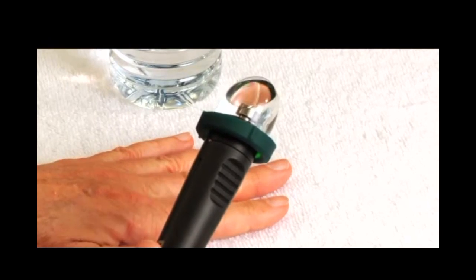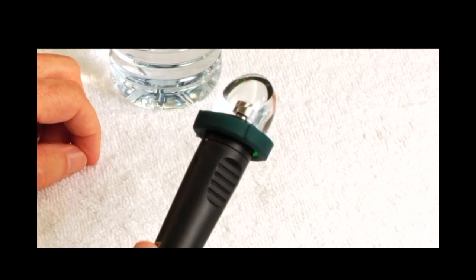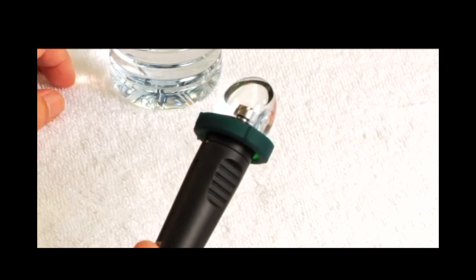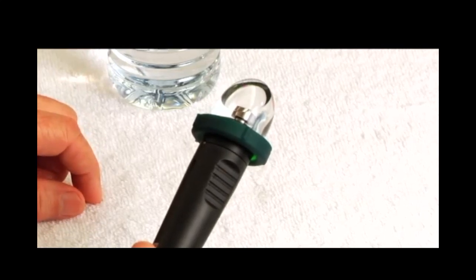Sometimes if I'm doing a scan, I'll see what appears to be a furry appearance on the top of the cornea. Those are wrinkles. To get rid of the wrinkles, and it's just aesthetics, because what's under the cornea is going to be accurately measured. But just for aesthetic purposes, to eliminate that, you can push that probe slightly in, and then they'll disappear because you've raised the pressure somewhat, eliminating the wrinkles.